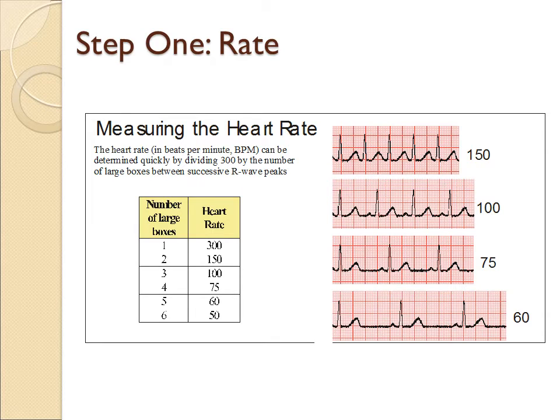An older method, but one that I gravitate to whenever I can't figure out where the 3-second lines are, and also one that I hear that Rita uses regularly, is the rapid estimation method using the thick lines. And so you basically go by where the thick line is, or the number of large boxes.